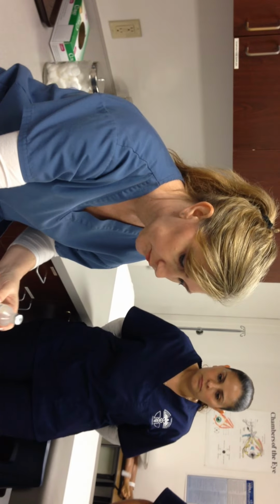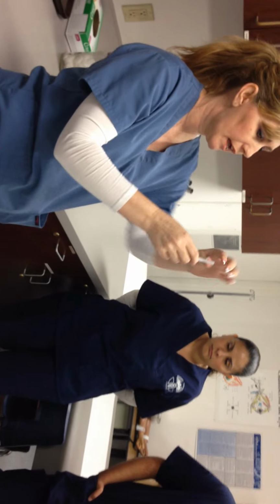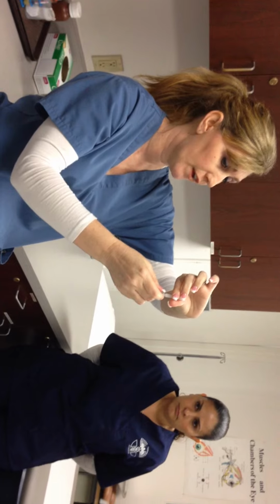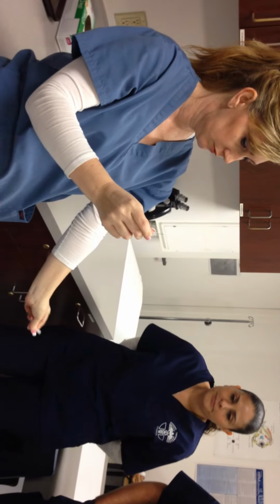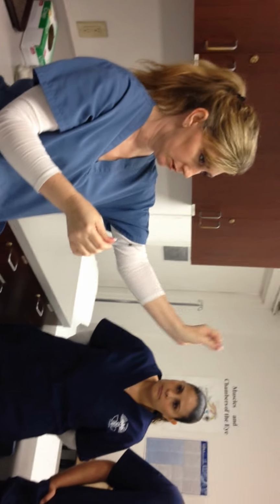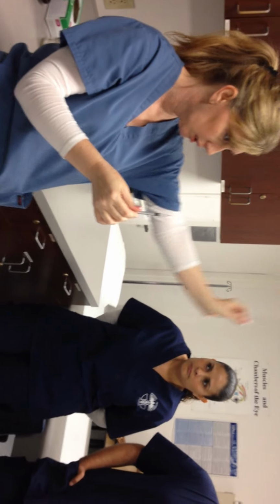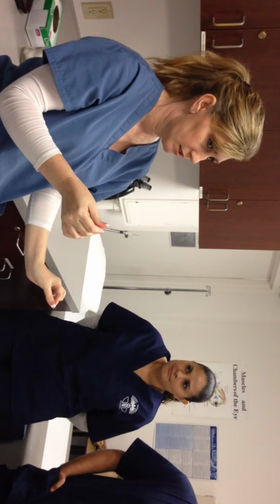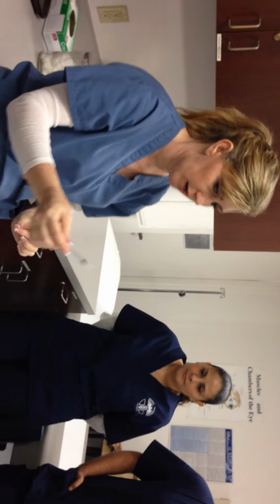So now, we have this, and remember, make sure this is on nice and tight. You're going to hold this one because this isn't a screw-on from this particular manufacturer, and we're going to do rainbow, right? Don't forget about the rainbow. Why? Because you're training your brain. Muscle memory. It looks ridiculous. It's really big, but eventually you'll just go like this. But for now, you're going to be doing it like this. We're training your brain.